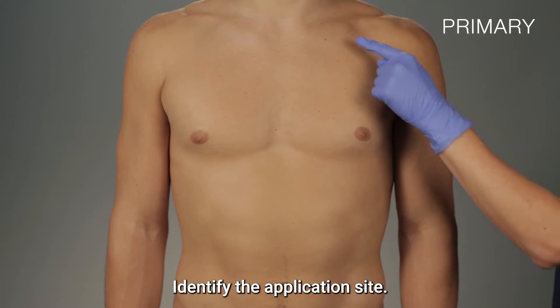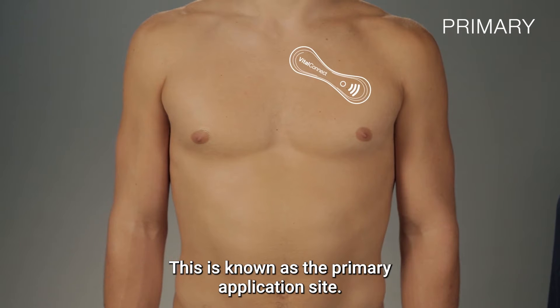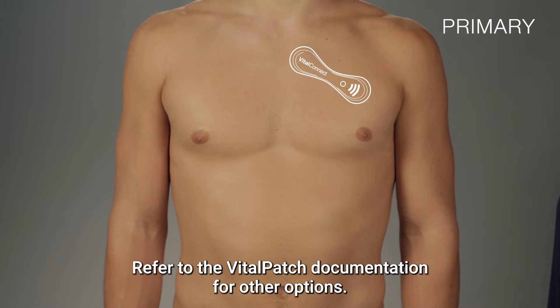Identify the application site. The Vitalpatch is typically applied on the upper left side of the patient's chest — this is known as the primary application site. Refer to the Vitalpatch documentation for other options.